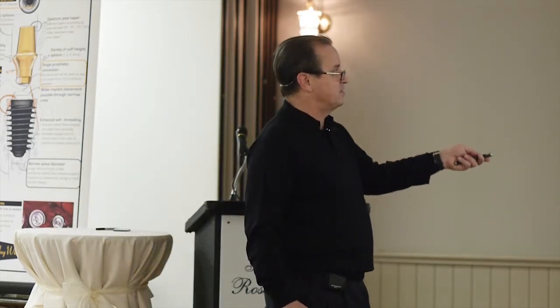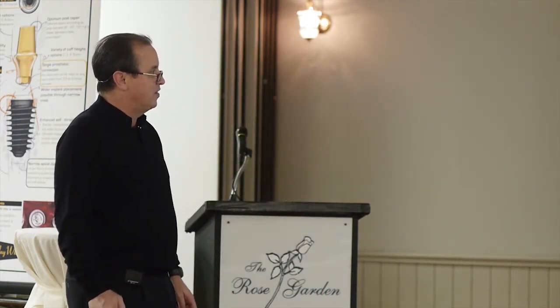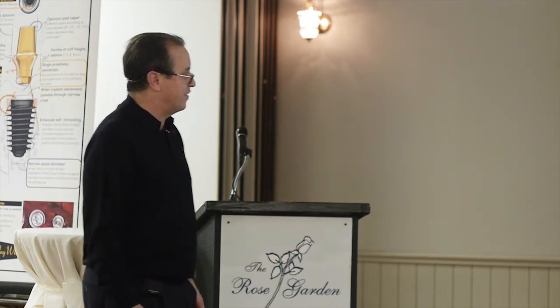Like I said, using this scan, same thing up here. We just lose this tooth. Look how thin this is. So you start seeing some things that you just don't see with conventional radiographs at all.